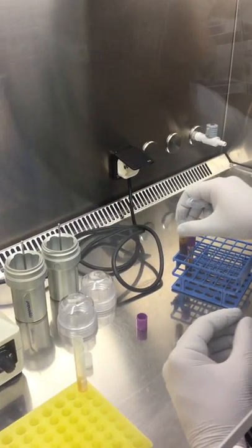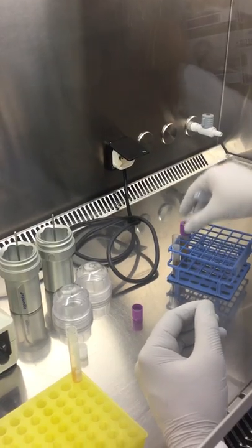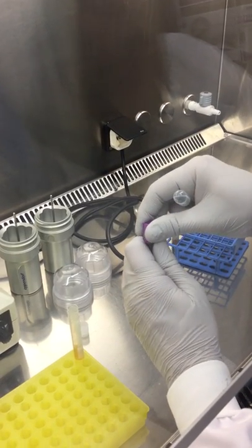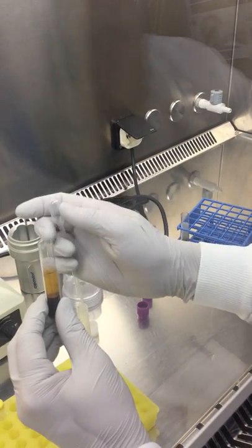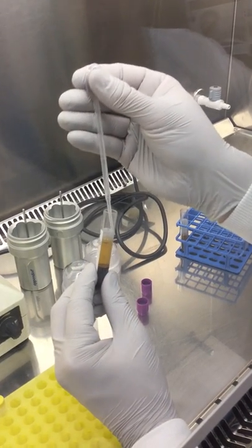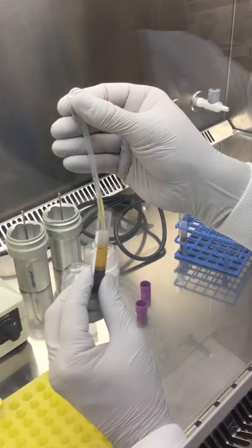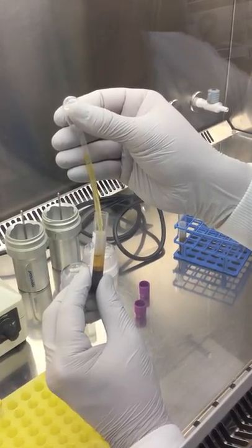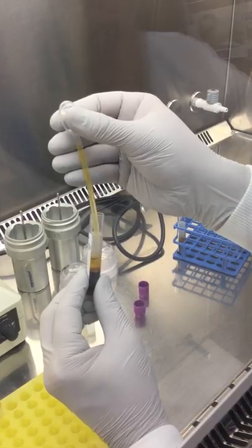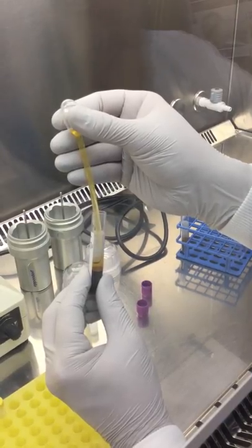So you can leave that there. The same again for the second tube. Off the plasma nice and carefully, being careful not to disturb the Buffy Coat.